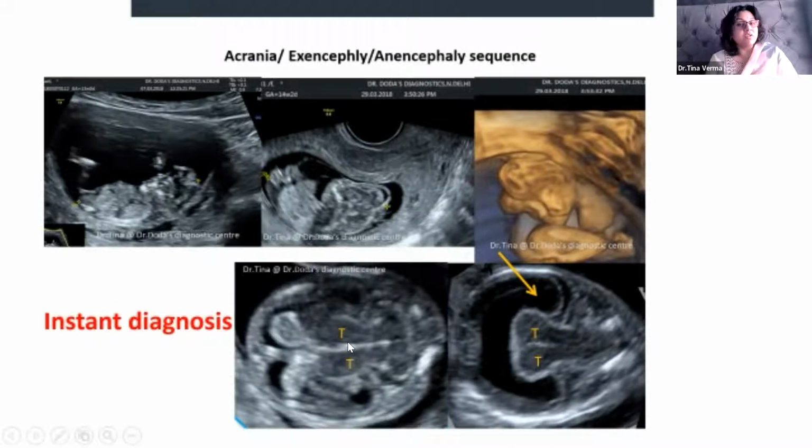If we move on to the third plane, the transcerebellar image, again, we have to document here the interhemispheric fissure separating the two cerebral hemispheres, the thalamus here, cerebrum and the cerebellum and their peduncles. In the next image, I find some abnormality. And what is that abnormality?